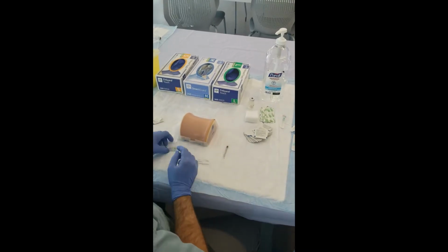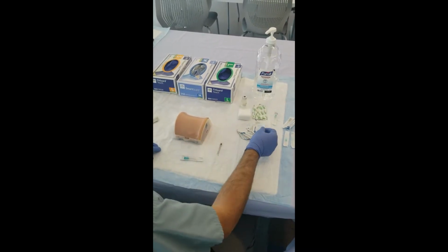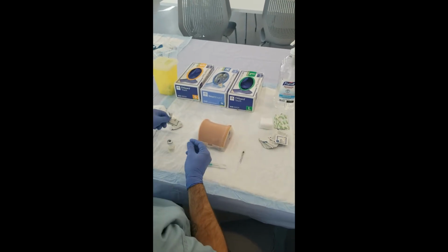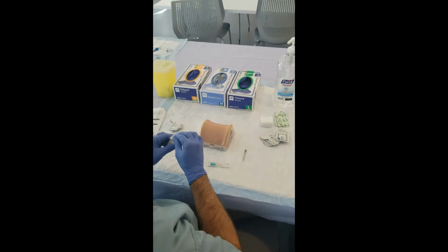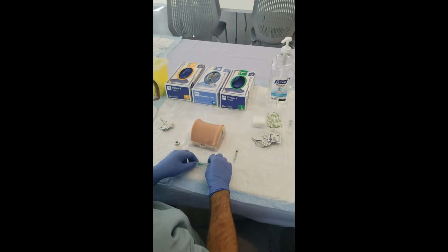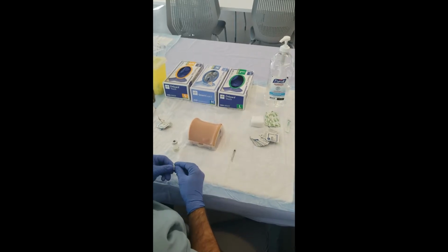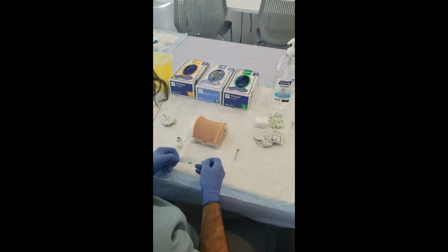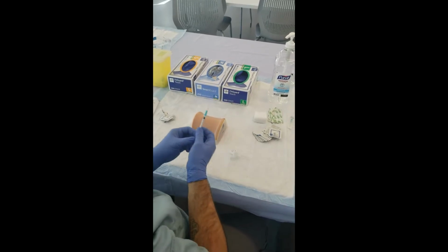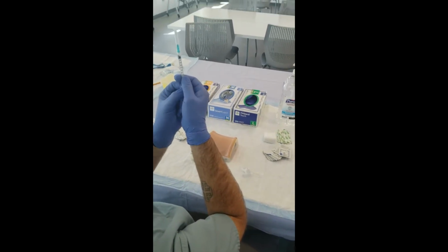Step 21, opened vial and cleaned with an alcohol pad. Step 22, withdrew correct volume of medication, 0.3 cc, and removed air from syringe. It is helpful to inject 0.3 cc air into the vial, then draw up the medication.